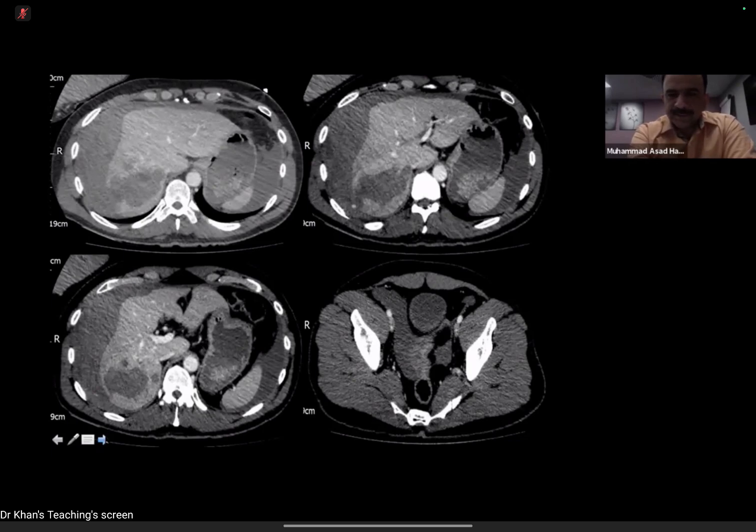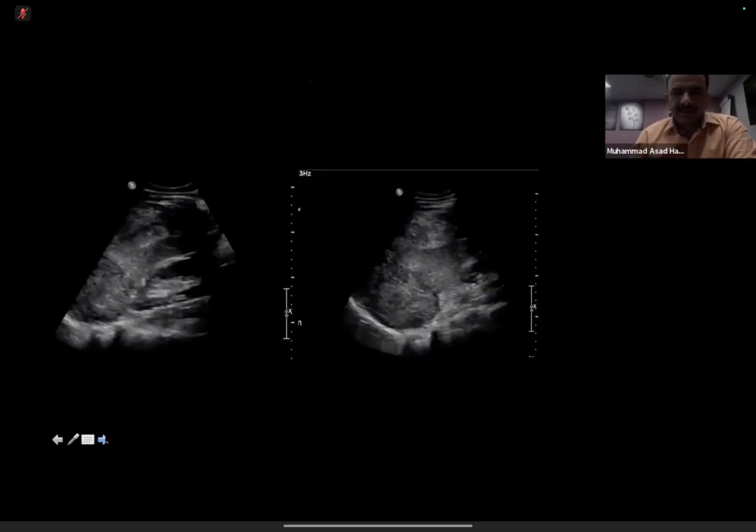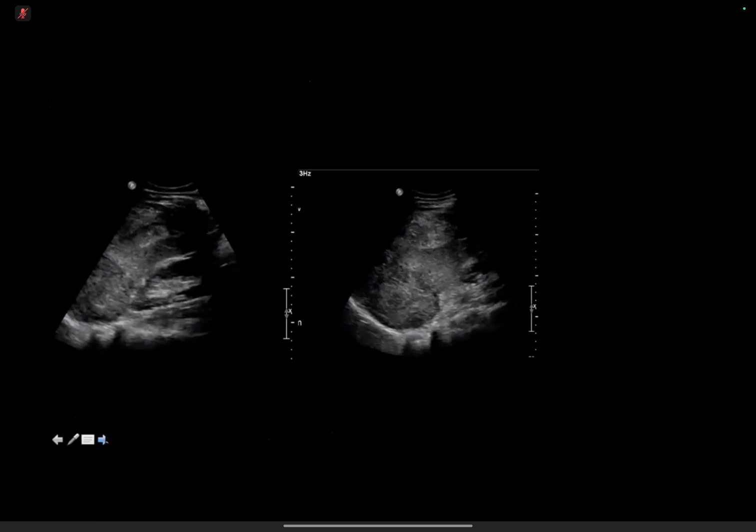What can interventional radiology do? We can access the celiac arteries and hepatic arteries and embolize the bleeder. Good. Maybe glue or coils. Good. Okay, this was the ultrasound which was done on the same night the patient presented. Can you describe the findings on this one?